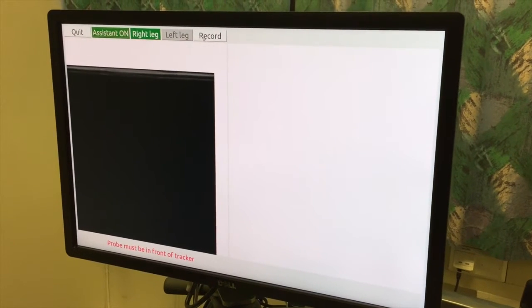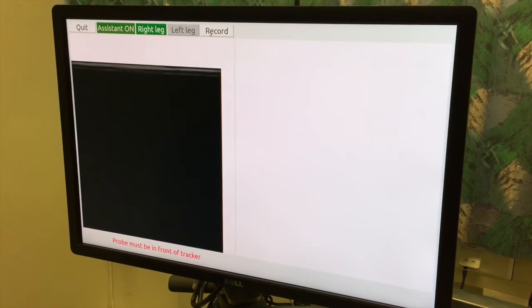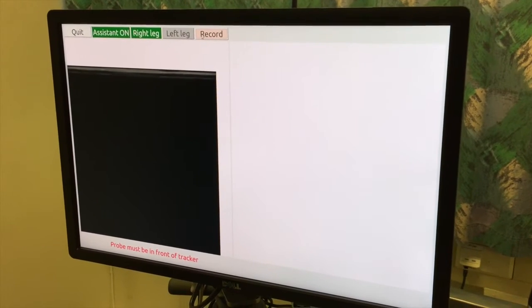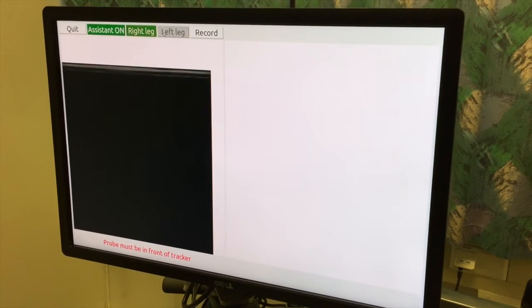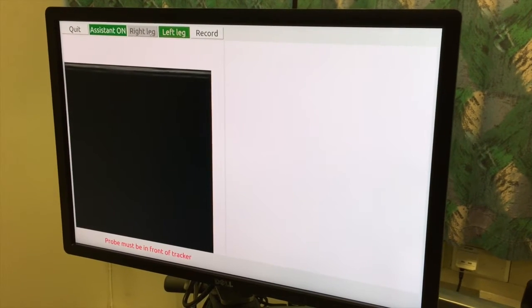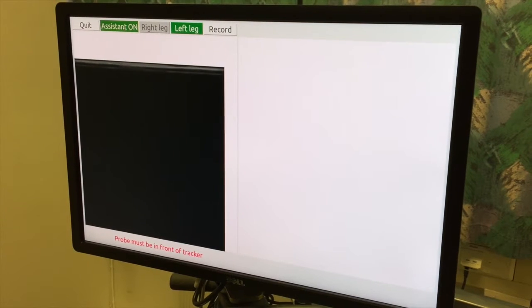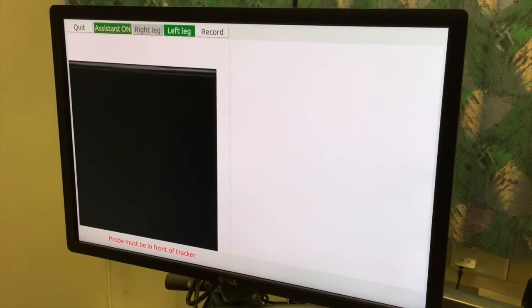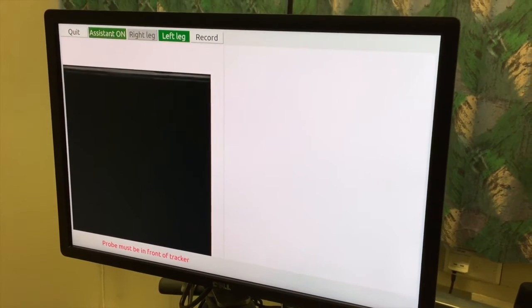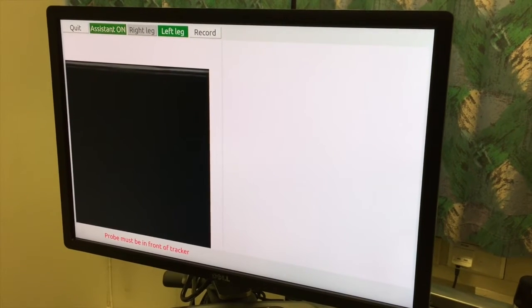Here we see the graphical user interface of the assistant. At the top we have five buttons. To the right we have the record button where we can record everything. Then we have two buttons — right leg and left leg — to toggle between the legs that are scanned. We can also turn the assistant software on and off: if it's off, we just show the ultrasound image; if it's on, we have the assistant software running. At the end, when we are finished, we can quit the assistant.